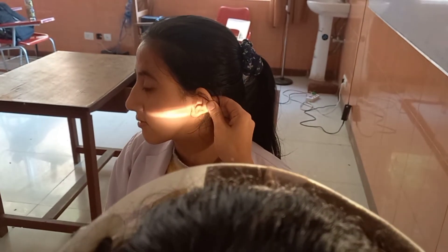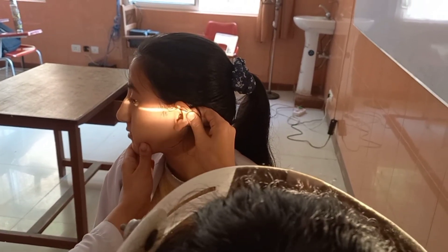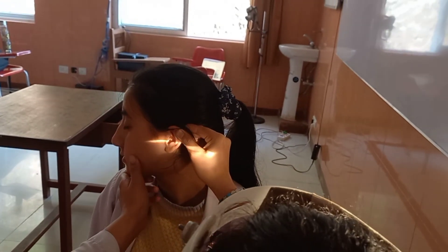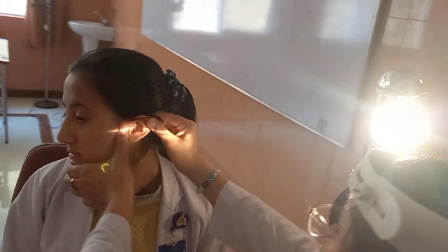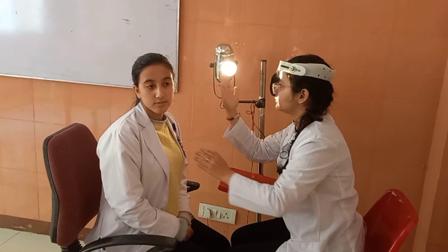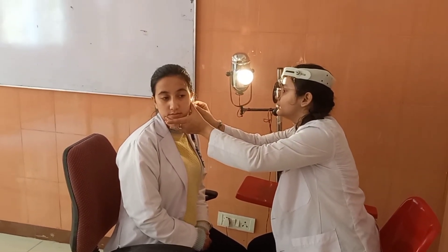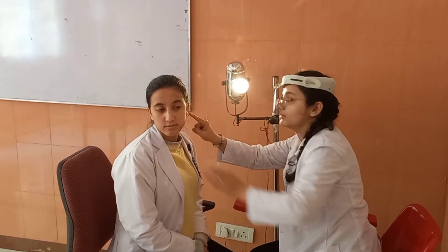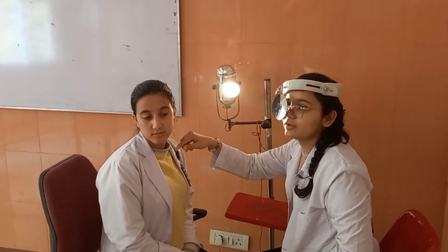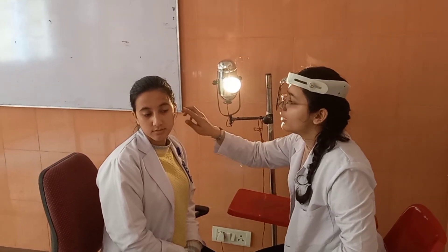After managing the position, put on your head mirror and try to focus the light first at your palm. If you can focus it at your palm, then focus it on the person's ear, nose, or throat. Here I'm focusing on her ear. To see inside the ear, you have to pull it upward, backward, and laterally. In this video I'll just talk about how to focus — I won't be explaining the full examination.